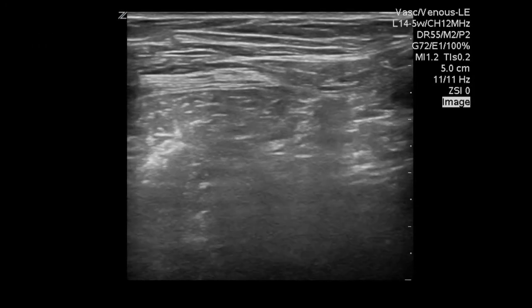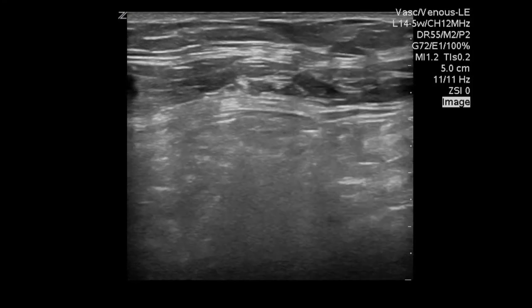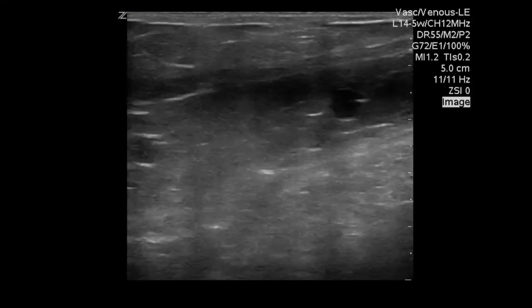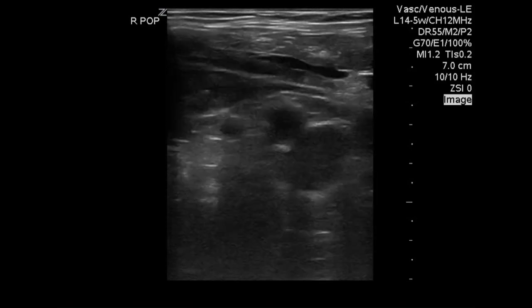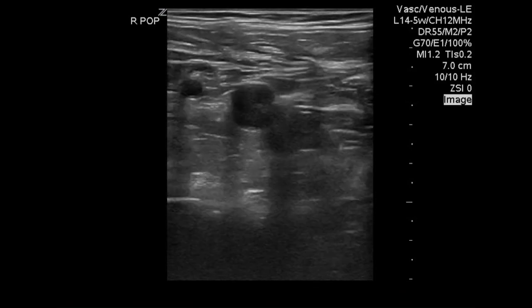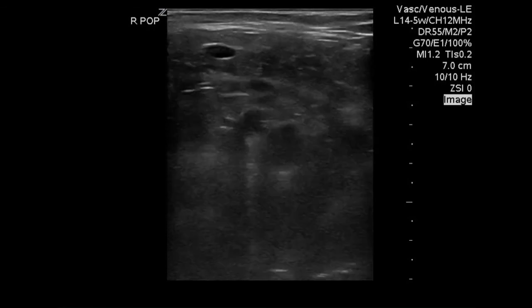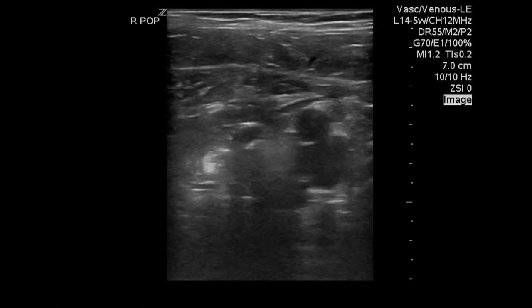Another common source of confusion is mistaking superficial vessels for deep vessels. Here it looks like we're visualizing major veins of the leg; however, if we zoom out, you can see that the real vessels of interest are deep to the vessels that we were scanning before. That's why it's important to have the anchoring anatomy of the femur or the tibial plateau to make sure that you're ruling out clot in the actual deep vessels.